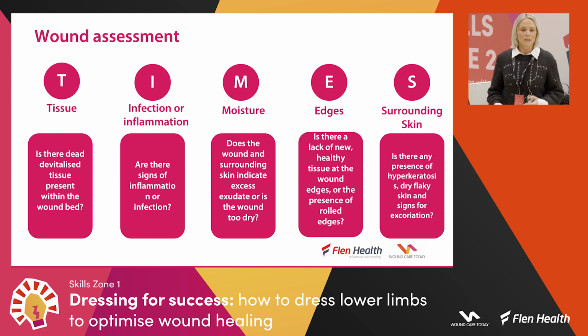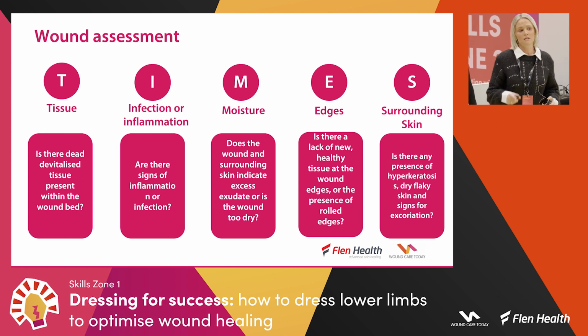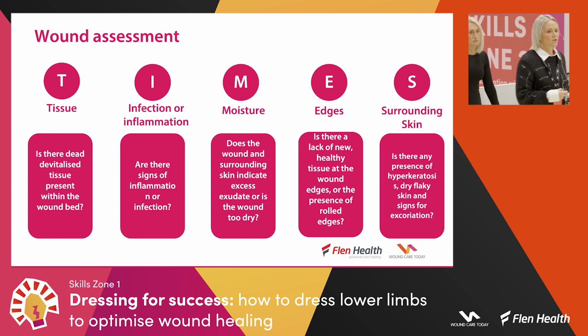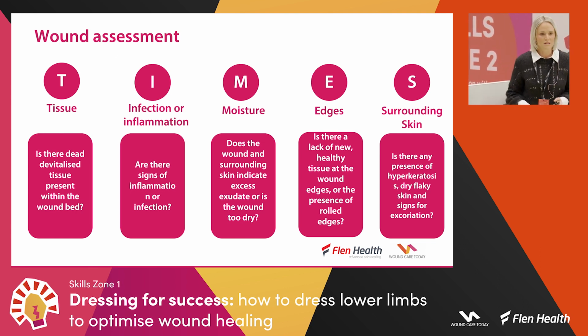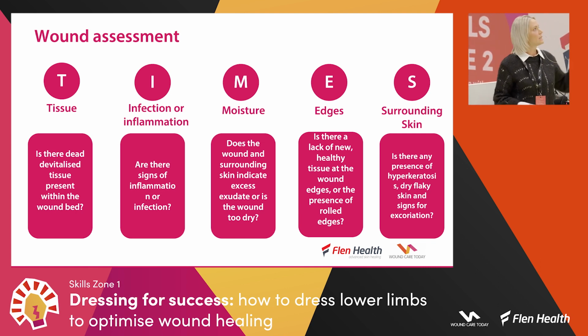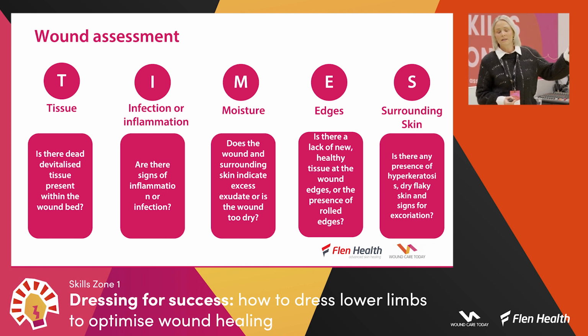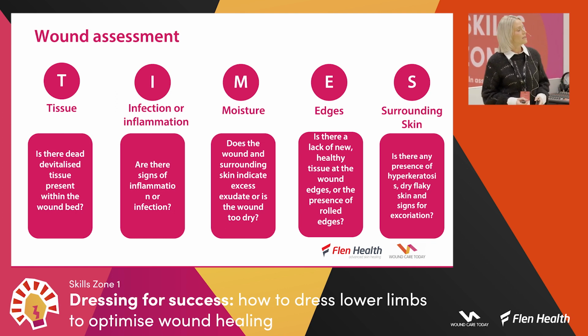So when we're looking at all of that full holistic assessment, it's only then that we look at our wound assessment. So you don't go to the cupboard straight away and get whatever dressing's available to you. We need to be completing some form of wound assessment. And the one we have here is the TIME assessment. Has everybody heard of the TIME assessment? Yeah. So today we'll be mainly focusing on the I. But if we just run through it, just to recap for ourselves.